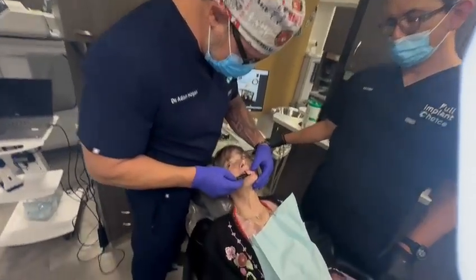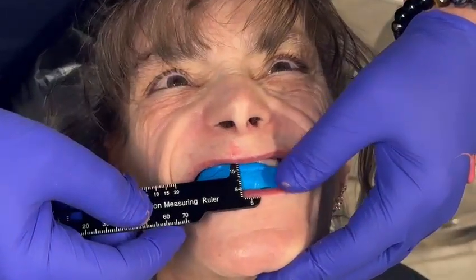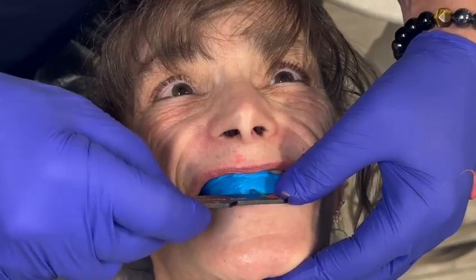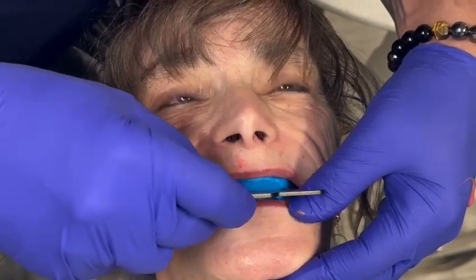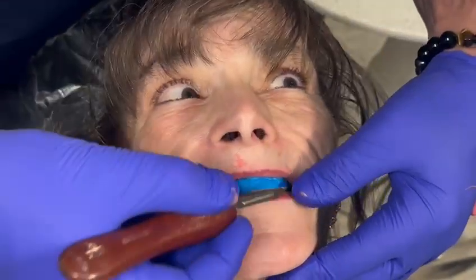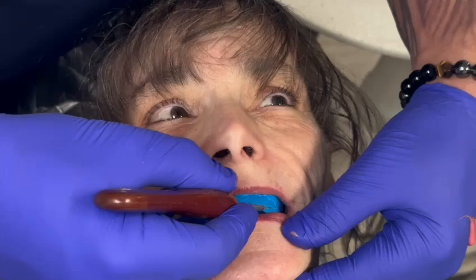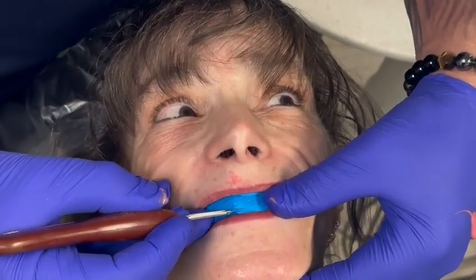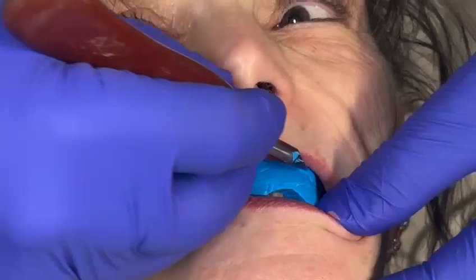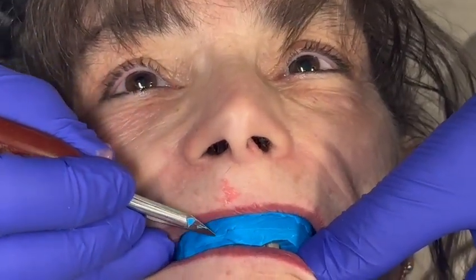Smile for me. Give me a big smile. Just keep your teeth together and smile real big. You get an idea already where you want to put teeth. We're going to mark this just like a wax rim. I can mark this just like a wax rim so I can kind of show my designer some things that I want to do here. I'm going to put a little geometry in it so that we can scan it really well.